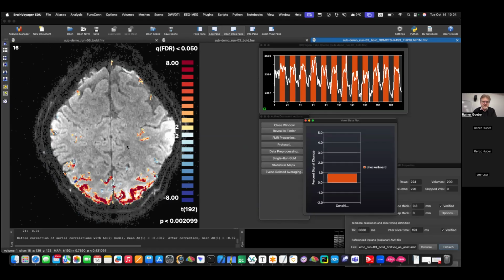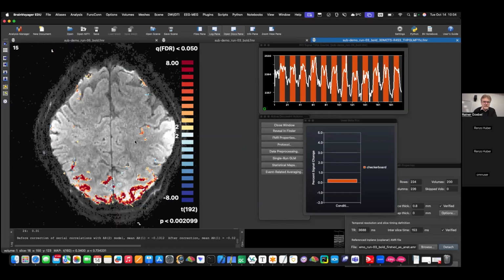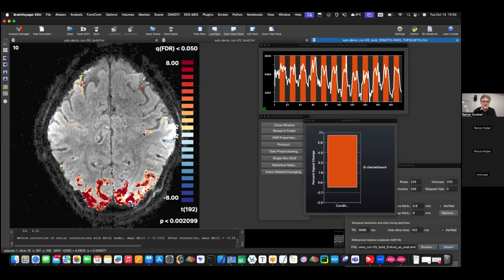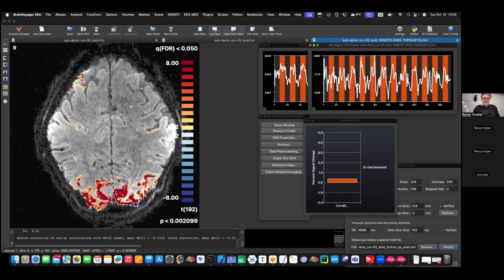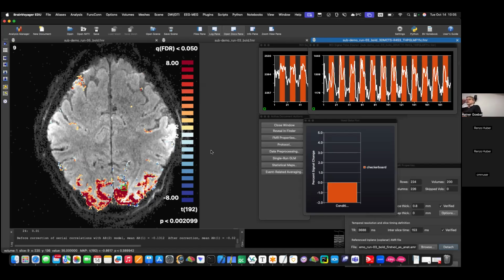which is still just one run. But you see in this one run, you have lots of frontal activity in visual stimulation, which people often do not report, right? Not this one here, this is not frontal. This maybe here. But the point is you have a lot of posterior activity, and look at the difference. It's pre-processed. That means your time courses look much more stationary, right?